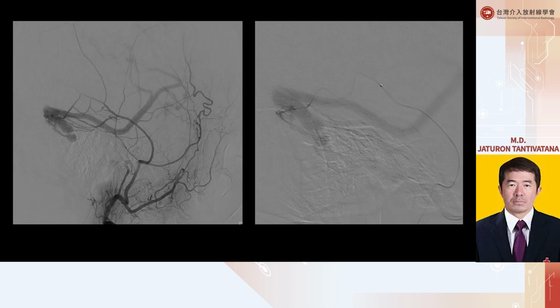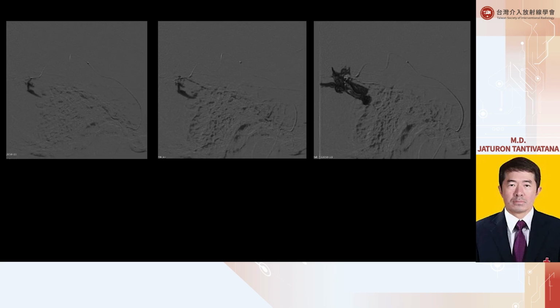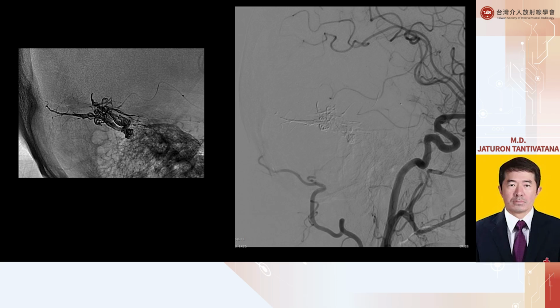Like in this example, the catheter is quite far into an almost wedged position in the nidus. This way, we can have a partial flow arrest or almost flow arrest of the solution, and we can inject the Onyx quite easily, like in this case. It's just about a 10 to 20 second pause between each injection. So then the Onyx migrates, and you can get the whole fistula inside. So this is the final case. You can see that sometimes there may be some reflux back into the anastomosis and into the other feeders. So this way you can get the whole AVM from just one feeder.